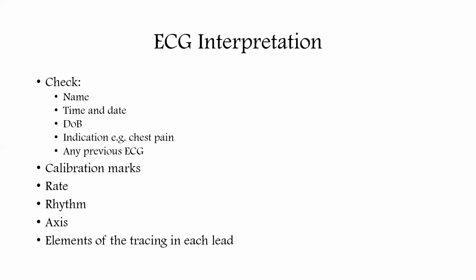Then the time and date becomes important. Date of birth, remember again, with ECG, because of issues with age, you might get issues. You need to know the age of your patient. Indication, the chest pain or any other indication. Does your patient have any previous ECG?